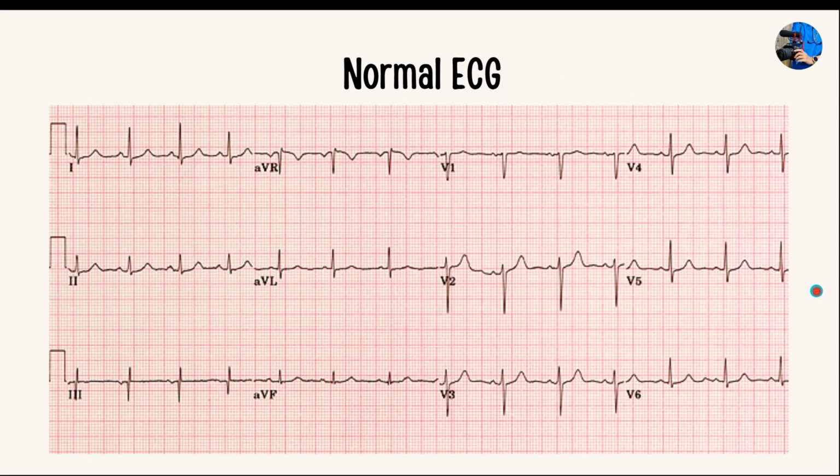So, I hope that you have seen a normal ECG. If you haven't, that's all right. I'm putting an example up here. This is a very standard normal ECG. This is something that hopefully, for all of our healthy individuals, this is what it would look like. Very quickly covering some basics.